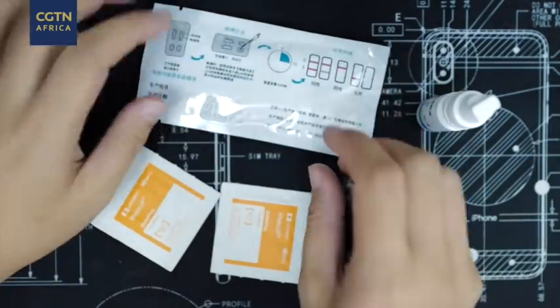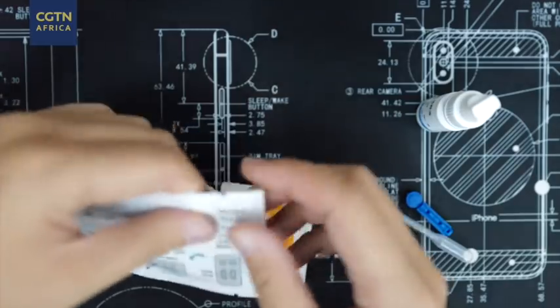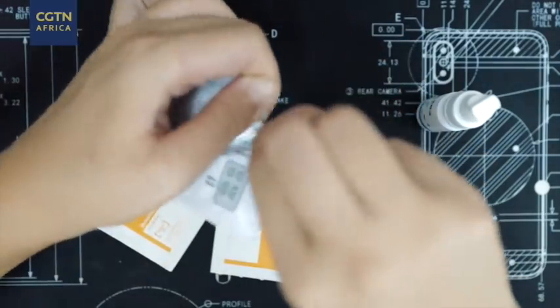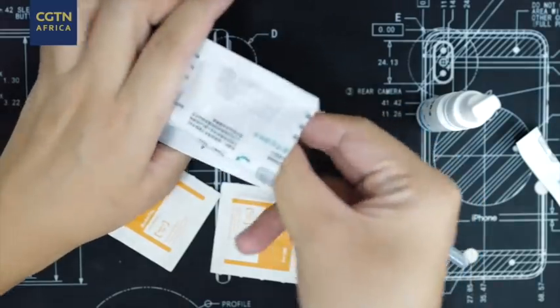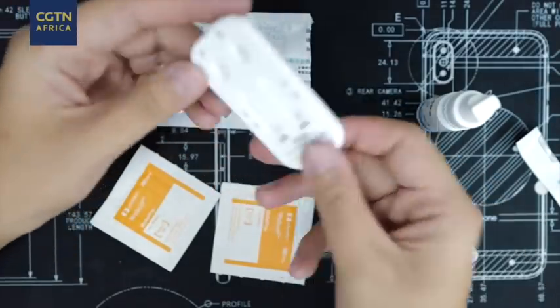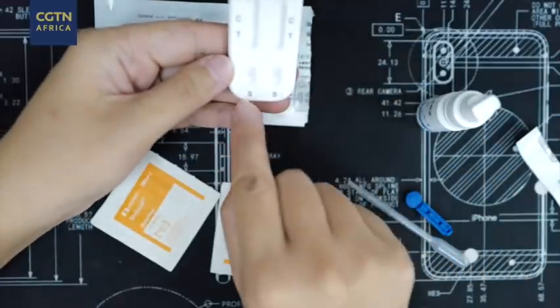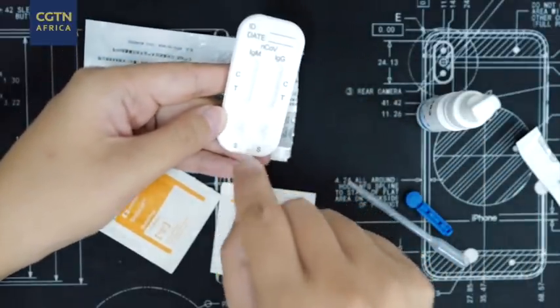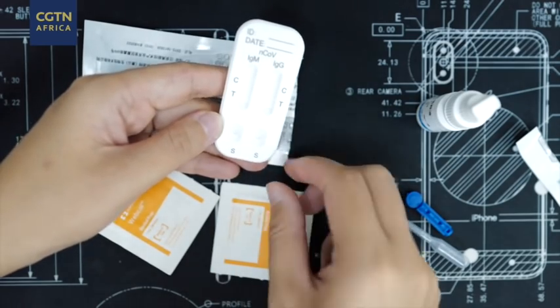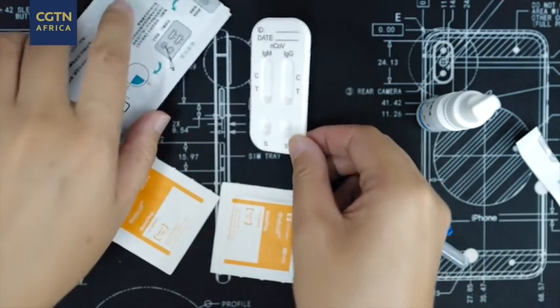Before that, I have already washed my hands. And then we can just open it. After you open it, you should use it as soon as possible. So here is the kit. You can see those are the two places. You need to drop your blood drop and also the diluent.